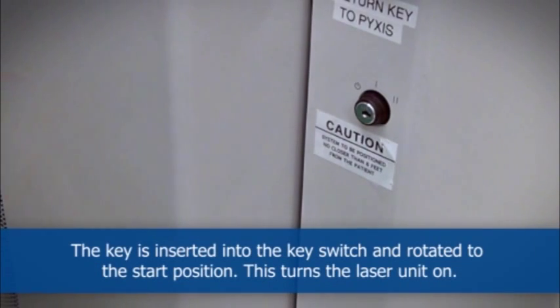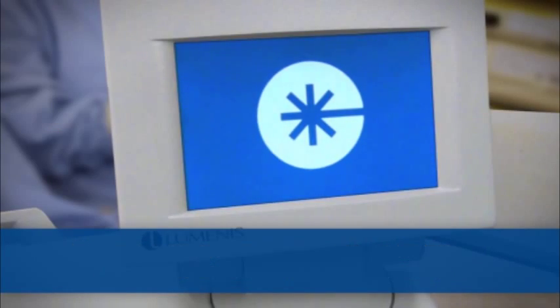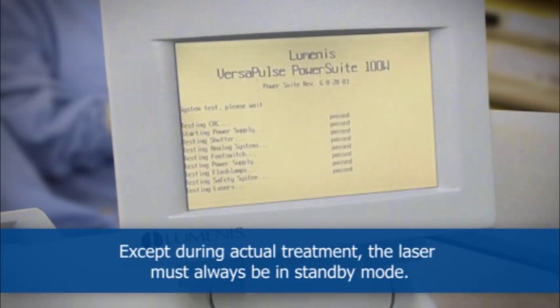The key is inserted into the key switch and rotated to the start position, which turns the laser unit on. After a laser self-test and warm-up, the default setting is standby mode. Except during actual treatment, the laser must always be in standby mode.